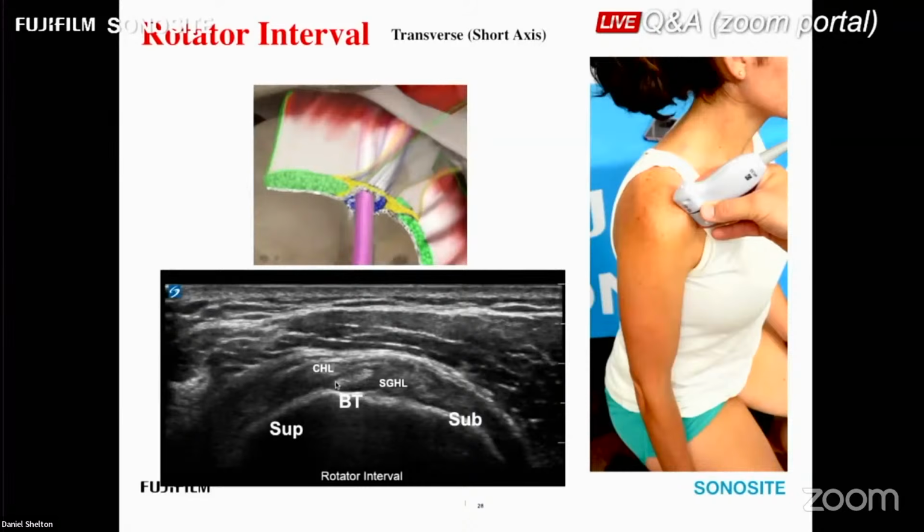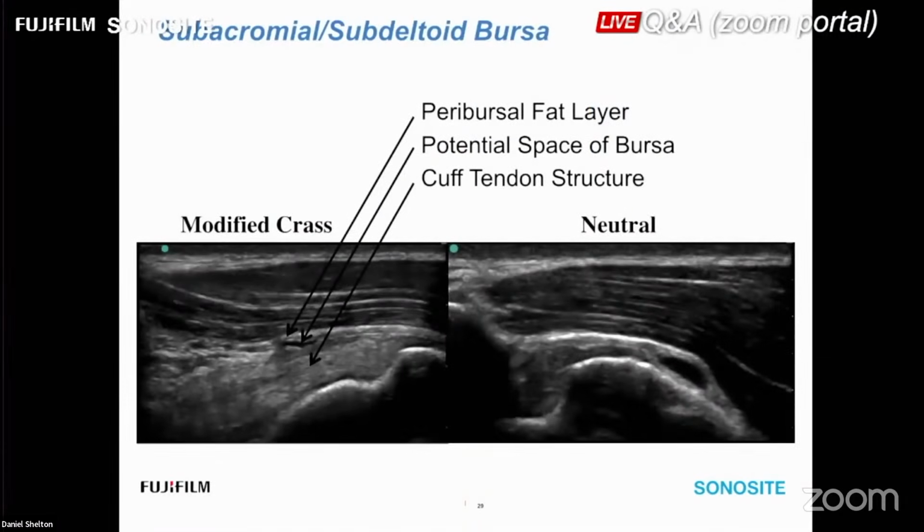So here we have the biceps tendon as this oval over the humeral head that is pretty rounded. It's irregular in shape because the biceps groove is kind of tapering away and we're about to hit the humeral head laterally. But the CHL and the SGHL are like this sling around the biceps. And we'll focus on that in the live demo. But the graphics are here for your future reference so that we don't spend too much time.